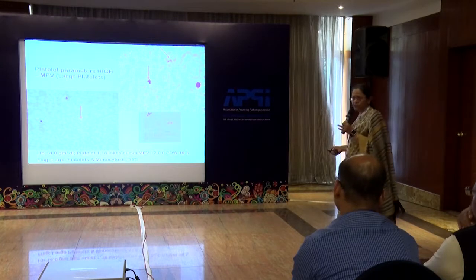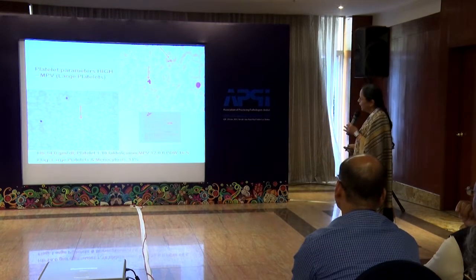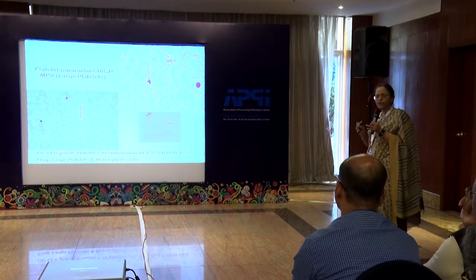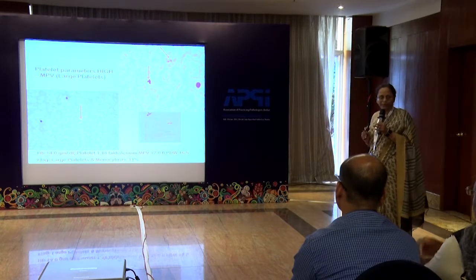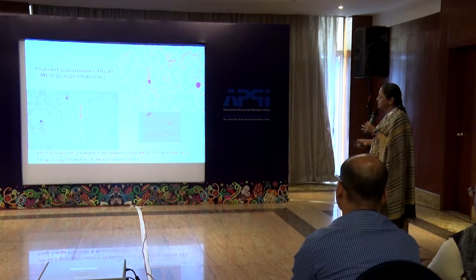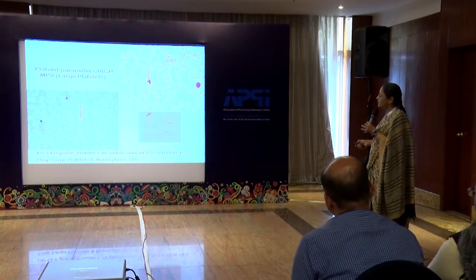a case of thrombocytopenia, and look at these platelets and look at the other cells that are going with it. Always don't look at one cell line. Look at all of them together, because all of them together come from the same source, which is the marrow. So you have platelets here, which are really large, almost the size of the accompanying red cells. They're rounded.